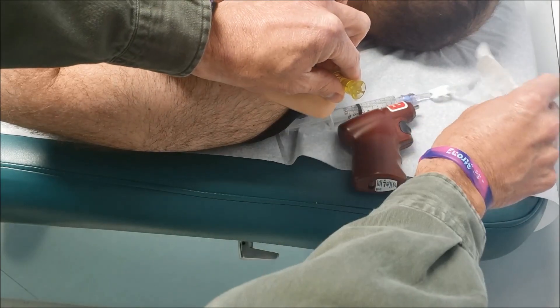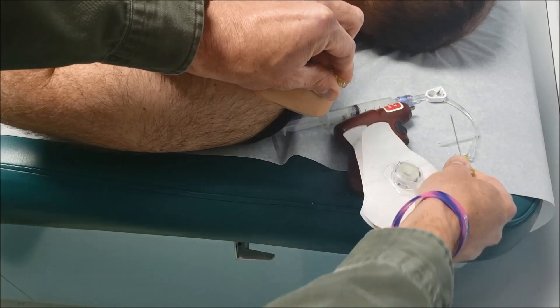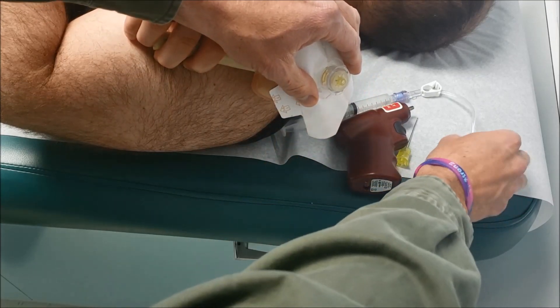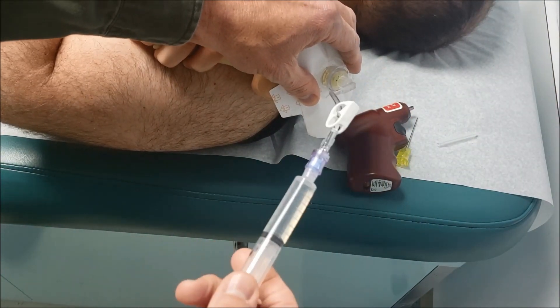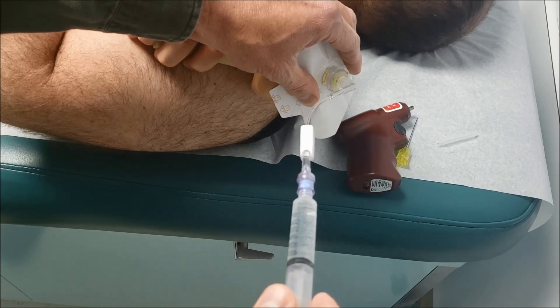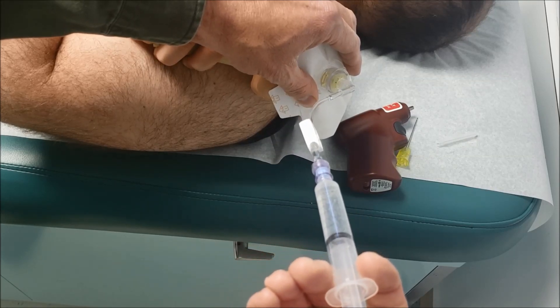I know that my placement is good because my needle is secure and stable in the bone. I'm going to unscrew the trocar, remove it, attach the IO stabilizer in position, and then hook up my EZIO connector. Once that's connected, I'm going to withdraw a little bit and see if I can get bone marrow — that's just a second way of confirming proper placement. Then I'm going to do a rapid 10 cc flush to create the pocket in the bone marrow for good IV fluid infiltration.